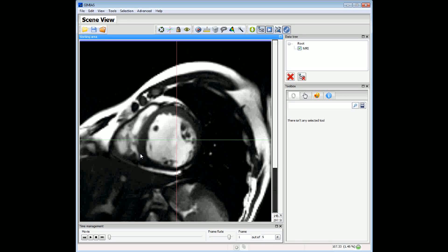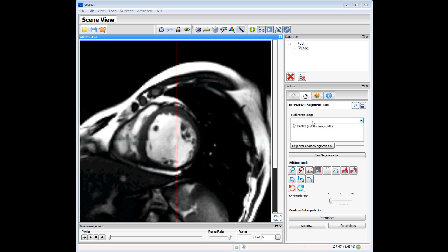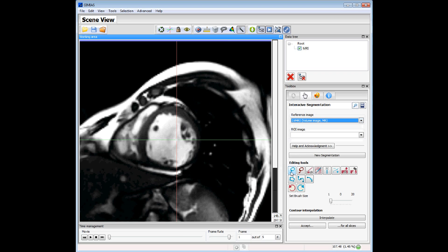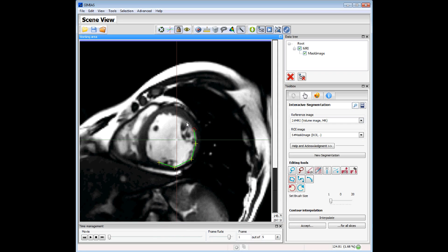This is the left ventricle. We will use this contour segmentation. The first thing is to select the reference image and start enabling the polygon segmentation. Using this tool we can define a set of control points using Shift and left mouse button. These control points define a contour.